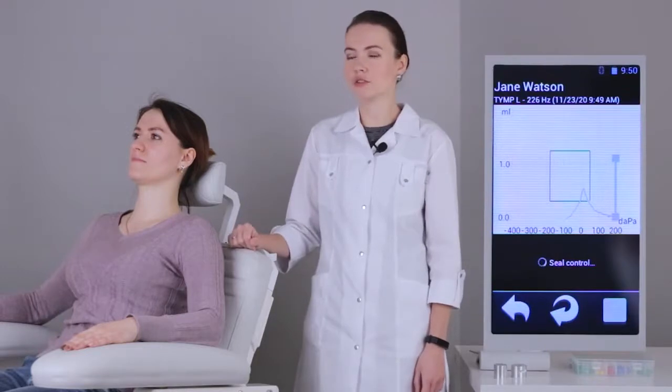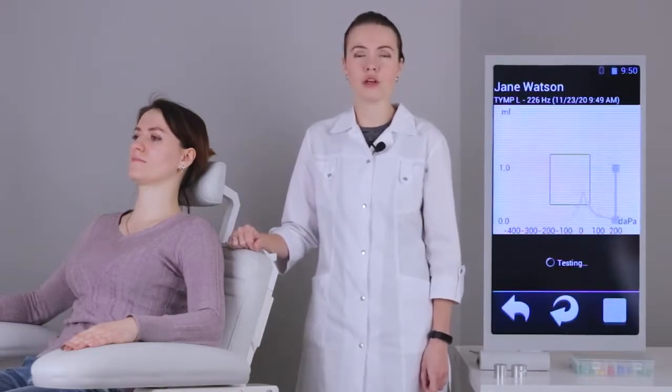Before acoustic reflex registration, we have performed tympanometry in our patient, so we know the peak pressure, and this value will be automatically used by the device in the acoustic reflex registration. If you have a new patient, you should firstly perform tympanometry. How can you do it? You can watch in the previous video.